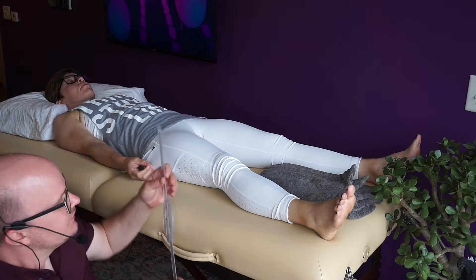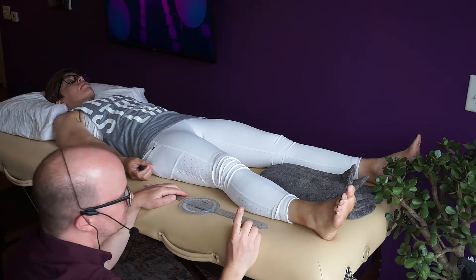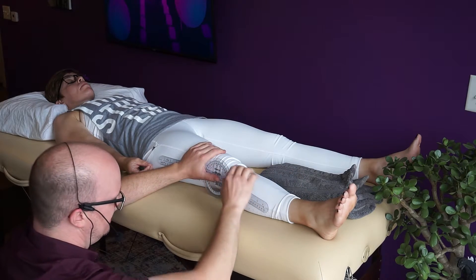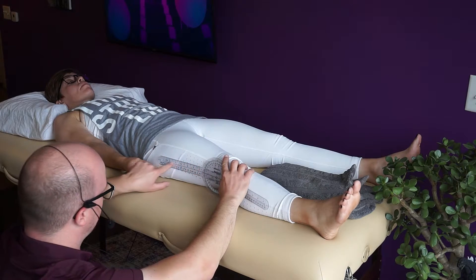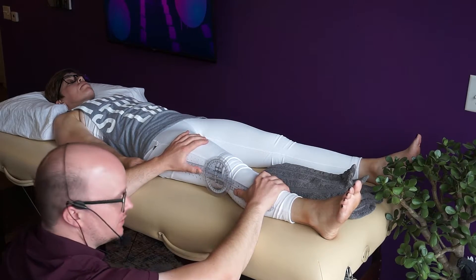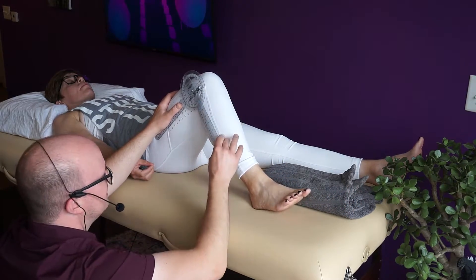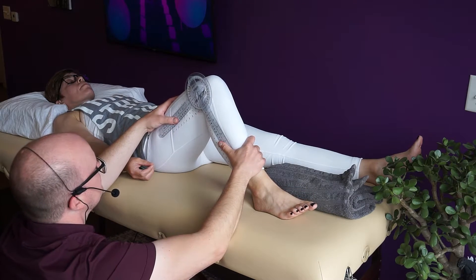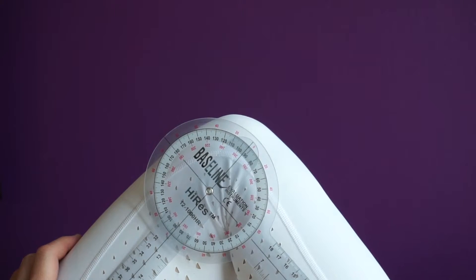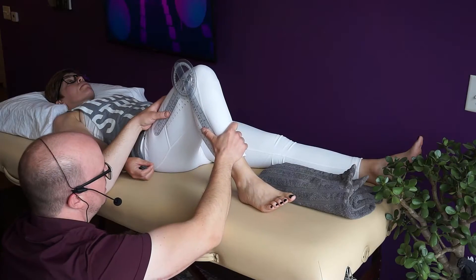We're going to do knee flexion first to understand the basic concepts. Take active measurements first, then passive. Line up the goniometer: lateral epicondyle for the axis, proximal arm to the greater trochanter, distal arm to the lateral malleolus. Always cue the patient to do it first. Can you flex your knee for me? If the goniometer moves, reline it up to the landmarks. As you can see, we have 93 degrees of active knee flexion. Then I apply pressure for the passive range of motion.